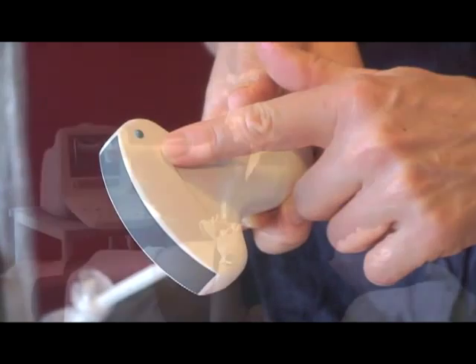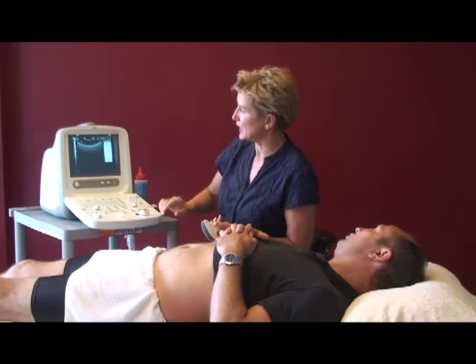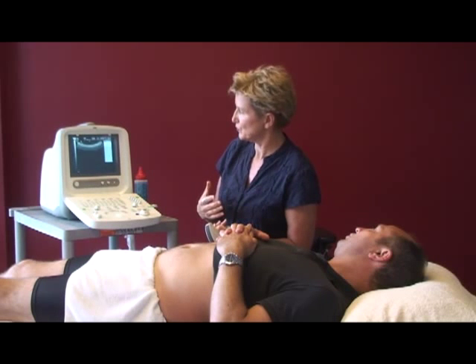And if we come on the screen here, you'll see the dot up the top here, so it's showing you which direction that they can relate to when you're assessing them.